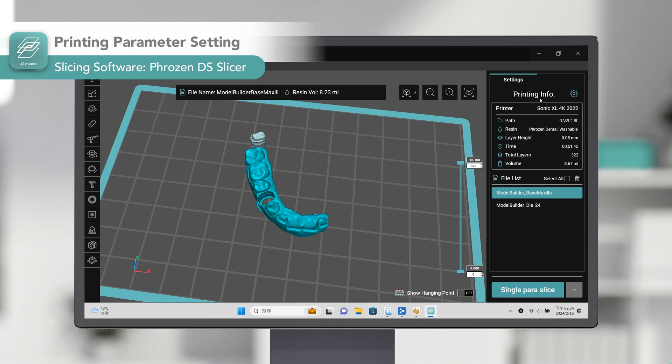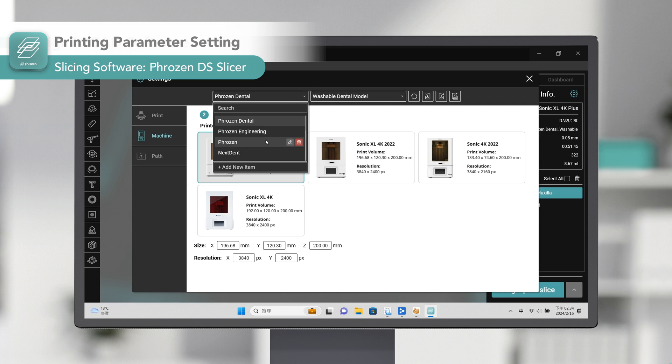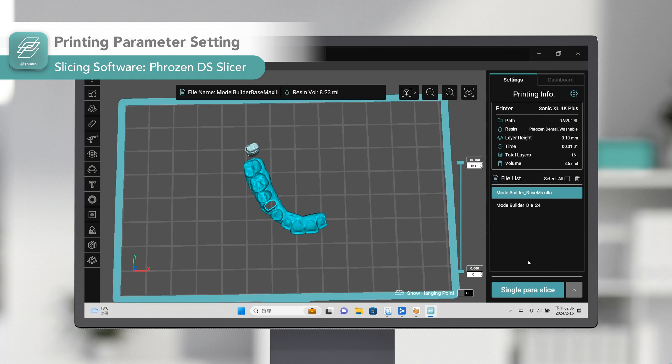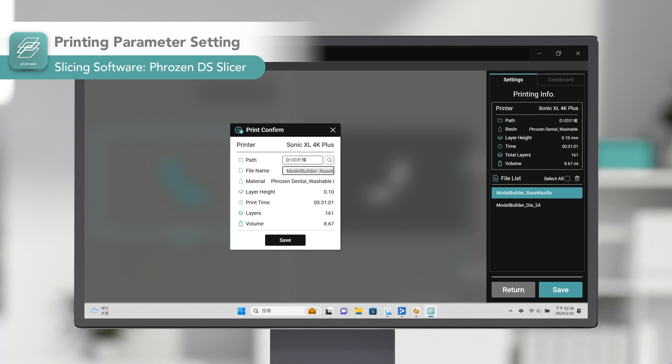Next, we are going to set the resin profile. Each printer and resin have different resin profiles, and choosing the proper settings is crucial for a successful and accurate print. However, DS Slicer provides pre-validated settings for all resins compatible with Frozen Dental printers — you only need to select your printer and resin, and it will prepare a ready-to-print file with the correct settings.